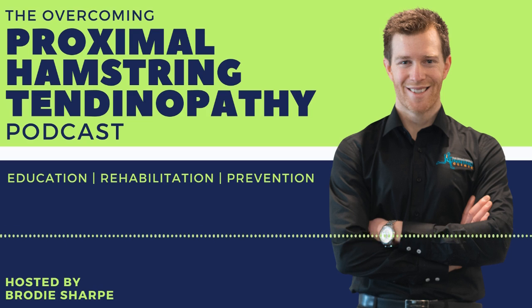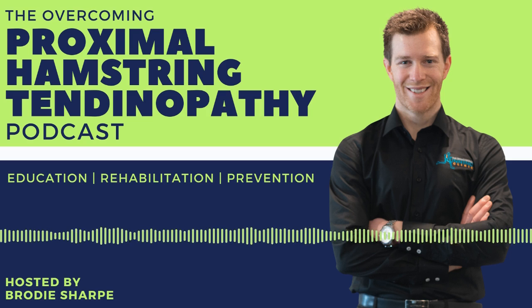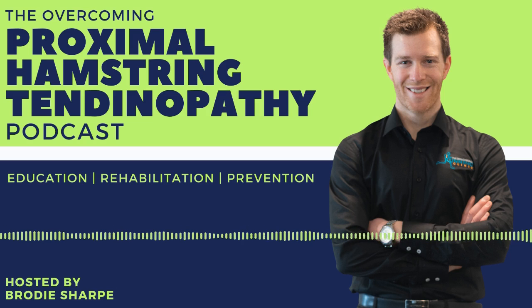And which does require a bit of insight and experience. Minimal dosage, so 3 sessions as a minimal dosage before you can actually work out whether you're responding well or not, and maximum 5 to 6 sessions. You shouldn't be going beyond that if you're not really responding and people aren't really giving you the loading exercises associated with it. It's not right for you, and you're just not responding.